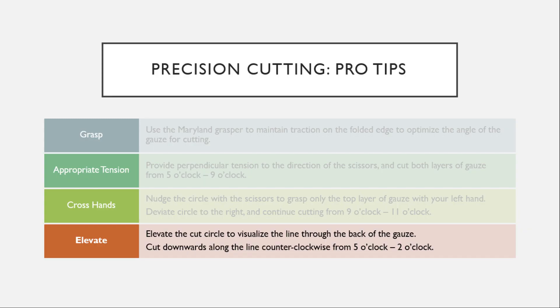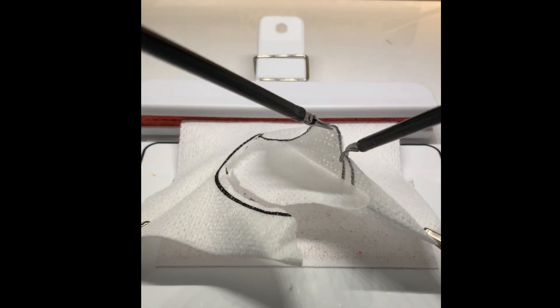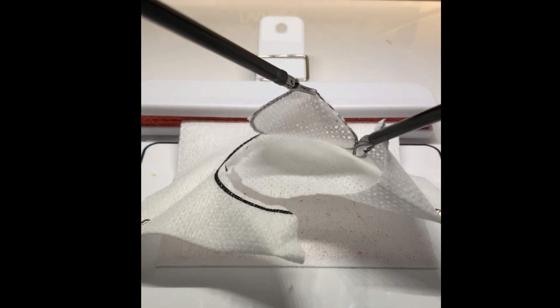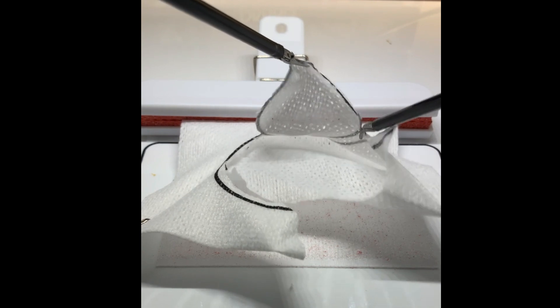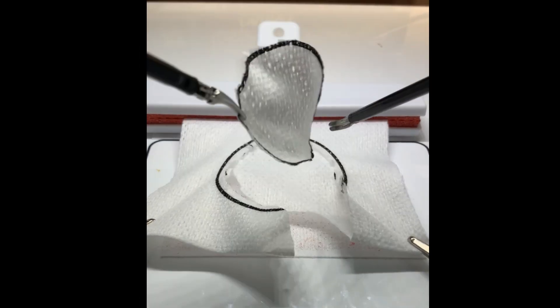Next you're going to turn your attention back to the 5 o'clock position and elevate the cut circle to visualize the line through the back of the gauze. You can then cut downwards along the line counterclockwise from 5 o'clock to 2 o'clock. You can then flip back to the normal orientation to finish cutting the circle.